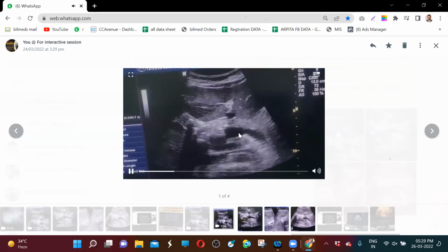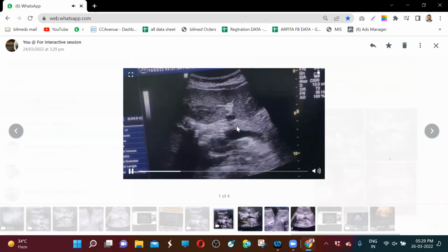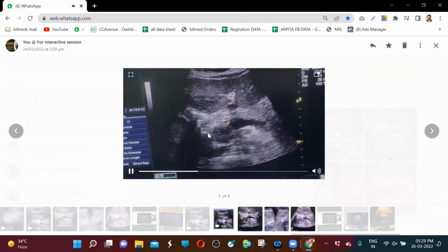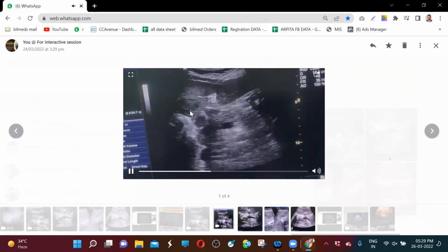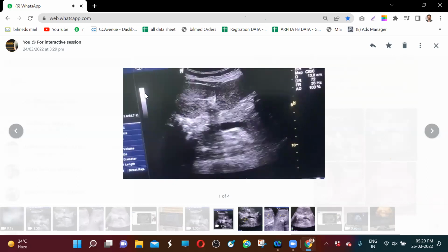It is over here. I am seeing the pancreas. Now see, the pancreatic area is over here. The doctor is worried about some hypoechoic, I will not say hypoechoic straightforward, some altered echo texture which is arising near to the pancreas, in between the pancreas and the liver. Please raise your hand to discuss this case with me.